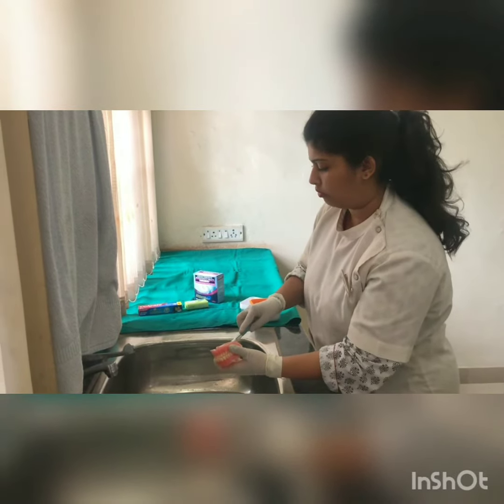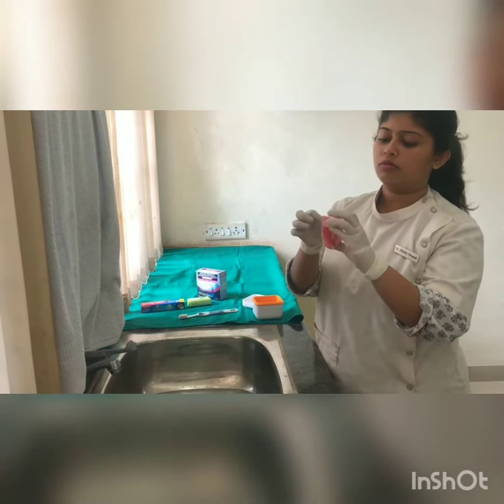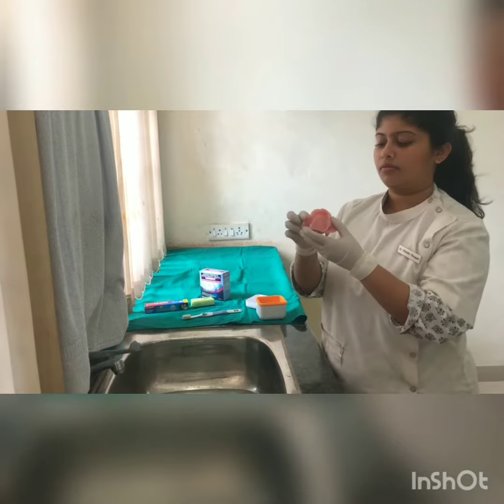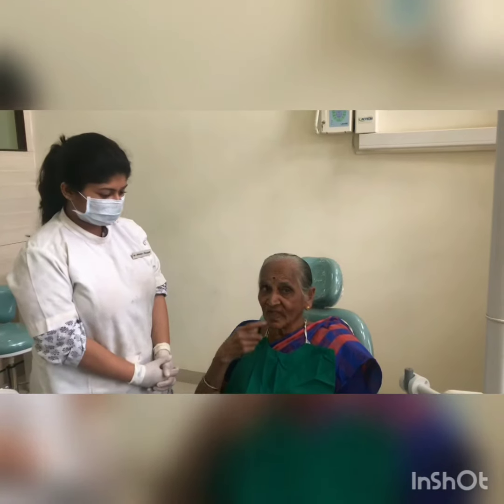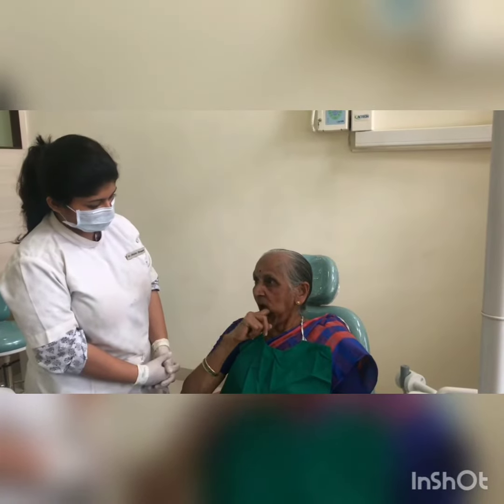Do not make any adjustments or repairs by yourself. After removing the dentures, massage the gums for a few minutes with your fingers.